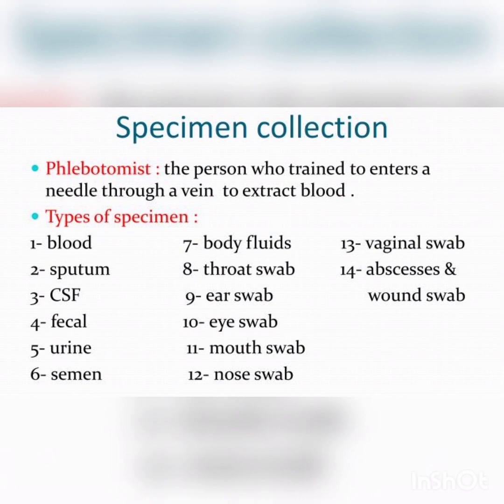So you will collect the CSF for study. Because the bacteria which causes meningitis is very sensitive to low temperature, it needs to be cultured immediately without any delay.